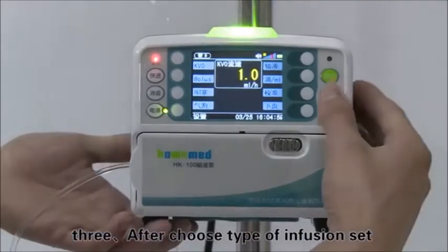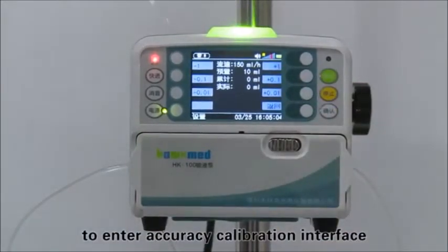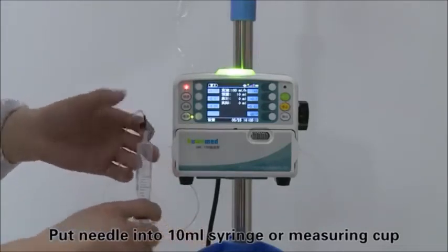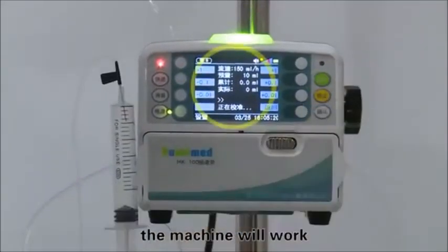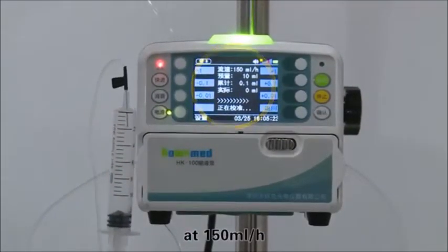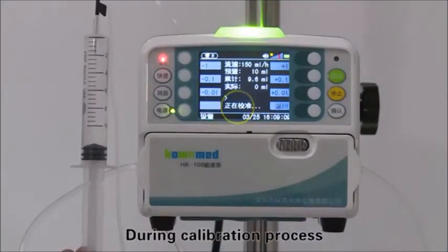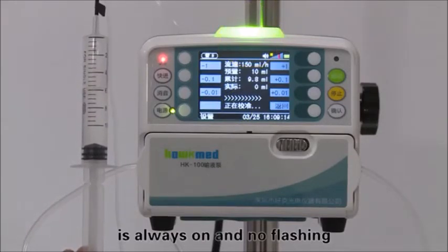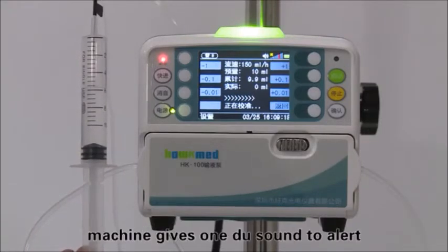After choosing the type of infusion set, press the accuracy soft key to enter the accuracy calibration interface. Put the needle into a 10 milliliter syringe or measuring cup, then press the start key. The machine will run at 150 milliliters per hour with a volume limit of 10 milliliters. During calibration, the green indicator light stays on without flashing. After 10 milliliters finish infusing, the machine gives a beep sound to alert you.